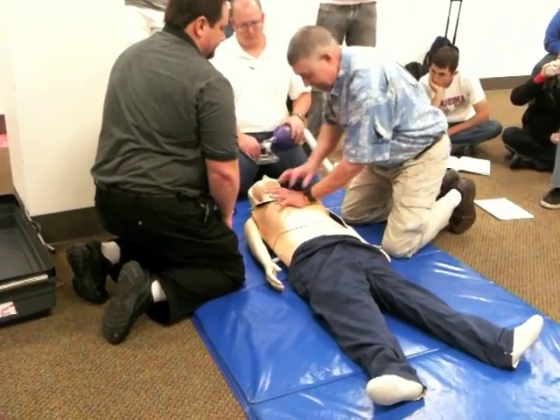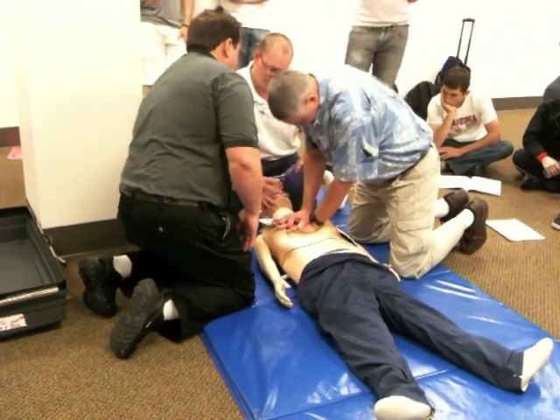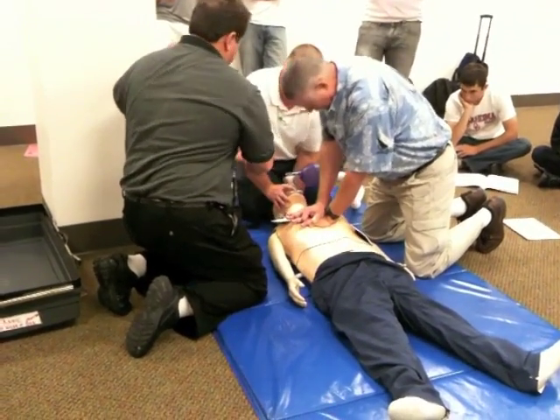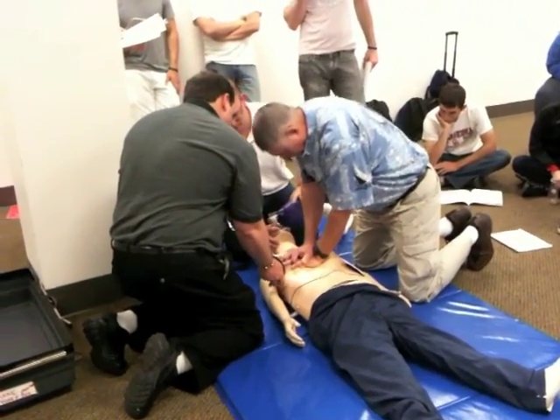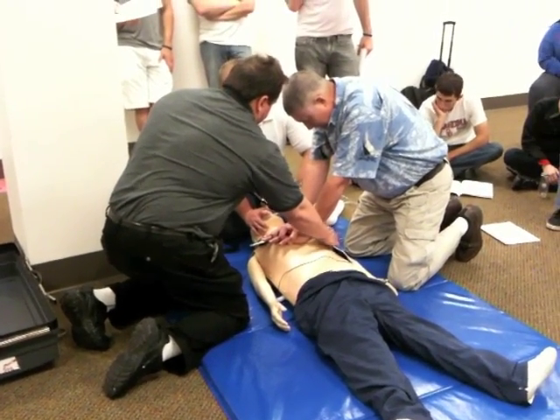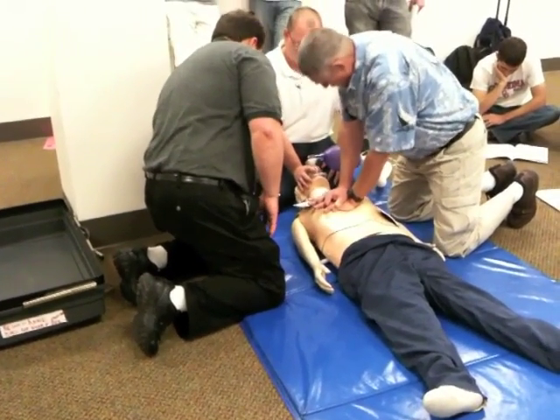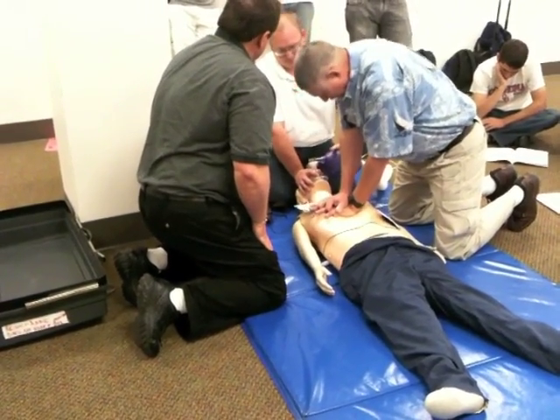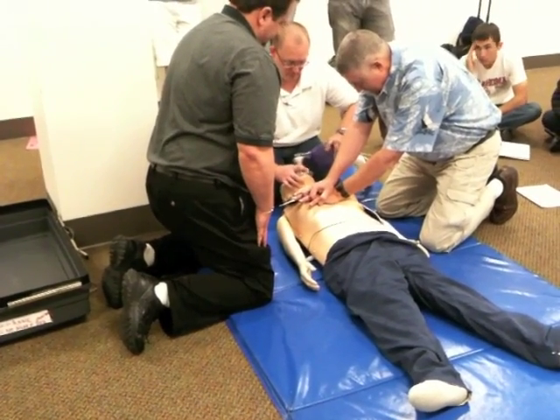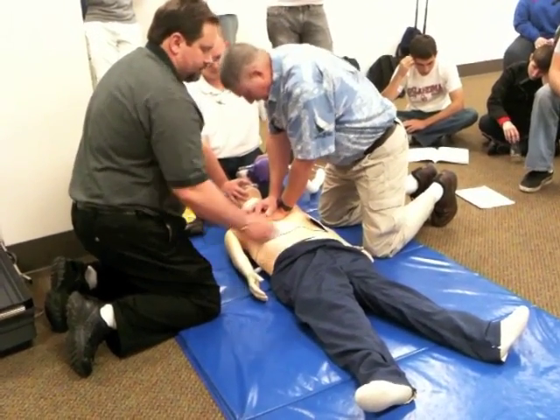Resume chest compressions, please. Provide chest compressions and ventilations. You're generating a pulse with each compression — count out loud from 20 to 30, please. Continue care. Ventilation. Continue. I'd have the long spine board ready. Continue care, then take it to the patient's side. After your next two breaths, we'll roll the patient and get them onto the long spine board. Rotate the patient onto their side, get the board under them, get them back on it, and begin chest compressions. Get them strapped down.